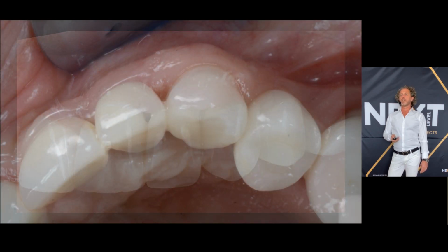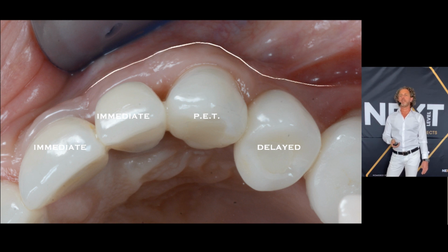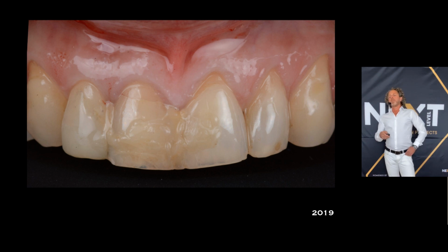And actually, this is the clinical image. And from the occlusal view, now we can see that we have 4 adjacent implants placed by myself previously. These are immediate implants, these are delayed, but the fourth one is the PET. And now you can definitely understand why PET is the winner, because it keeps the volume properly. Let me show you a new case from last year.